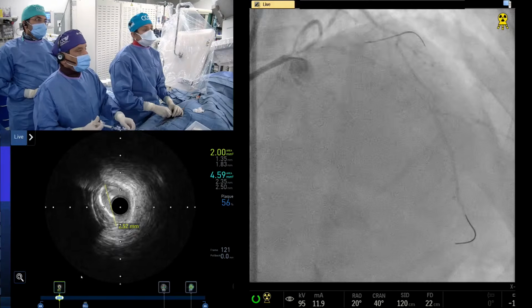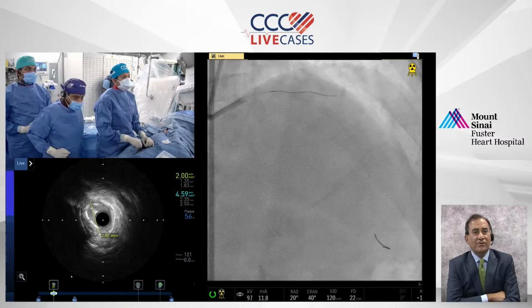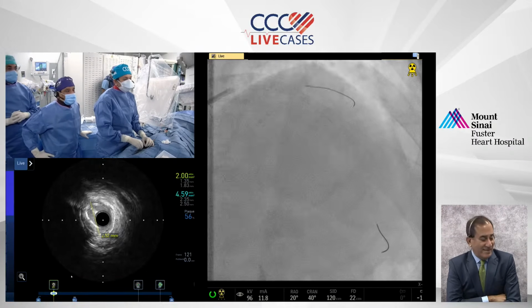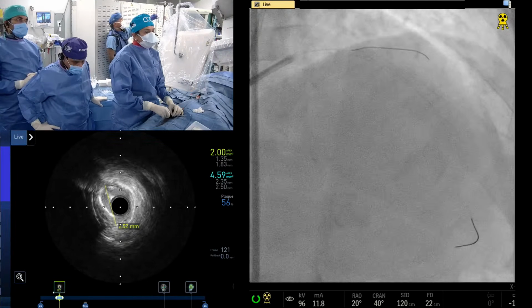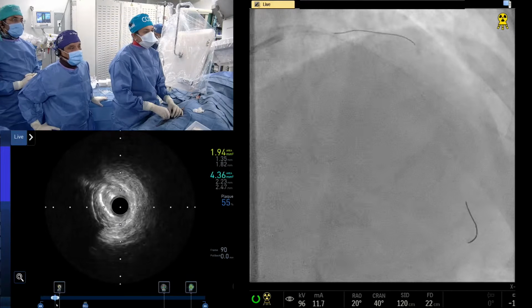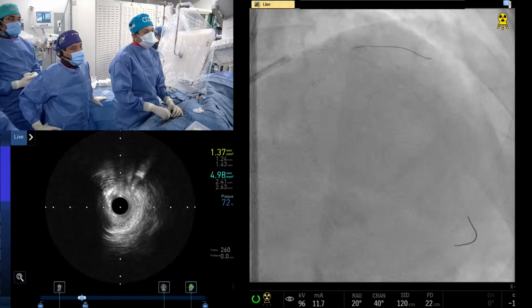First time, Samin, in knowing you for 41 years, have I known you to struggle with a name. I think you will, before this case is over, you'll remember it. Yes, definitely I will remember. And that was a trial for small vessels comparing Rota versus PTCA, and Mark Reisman was the PI.